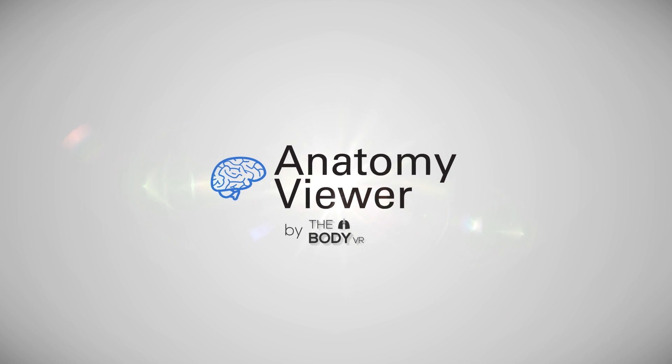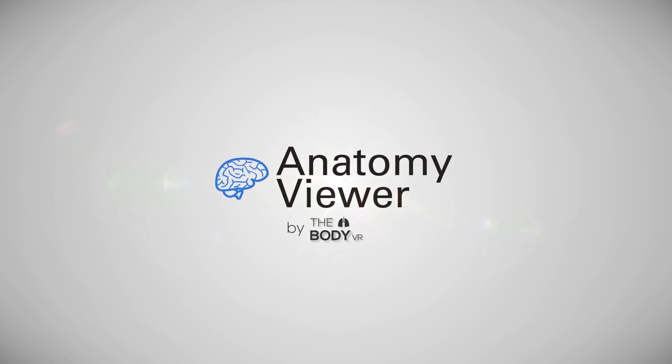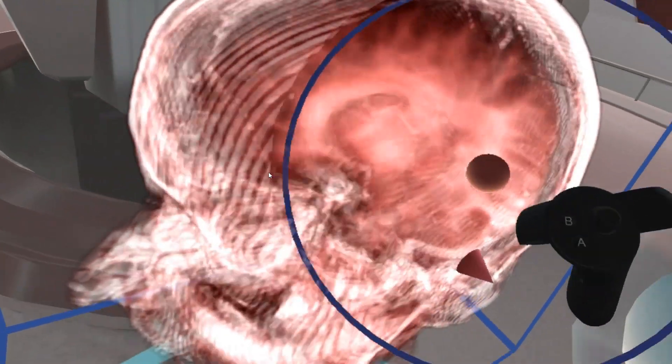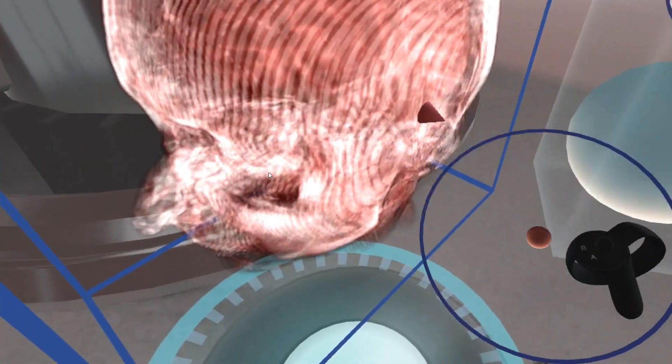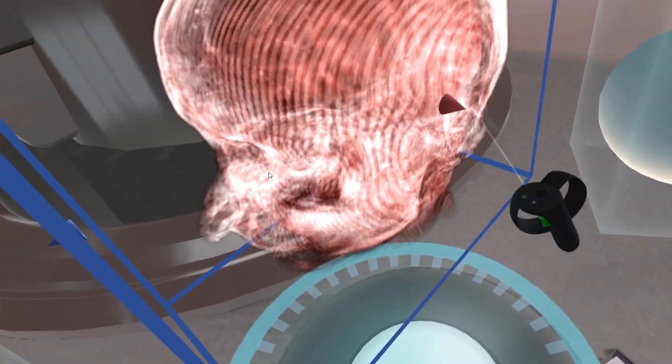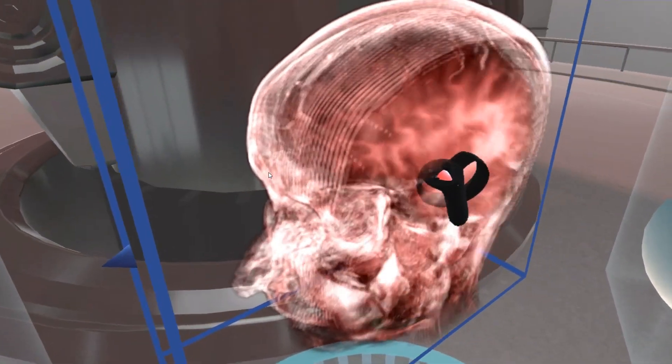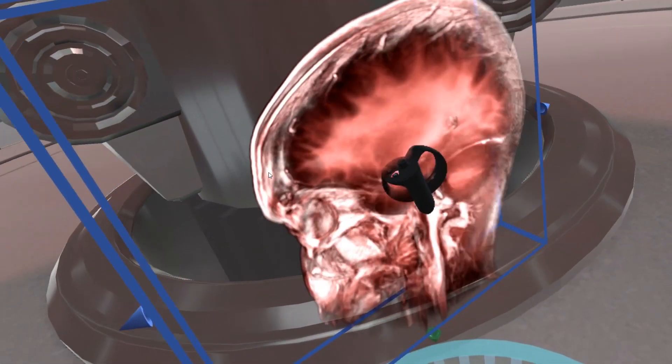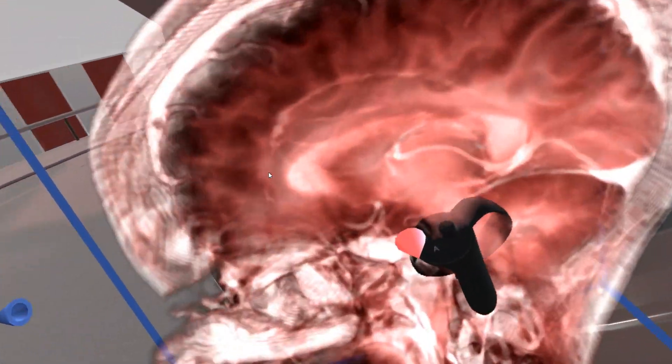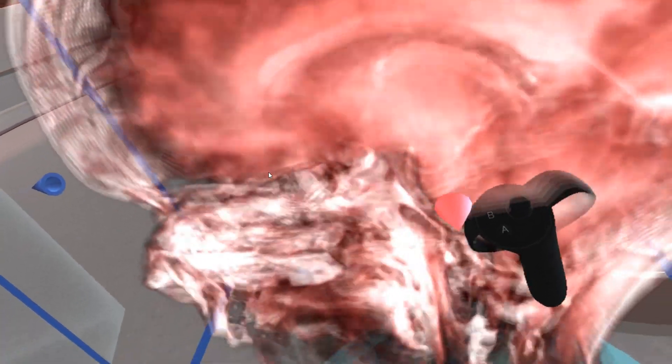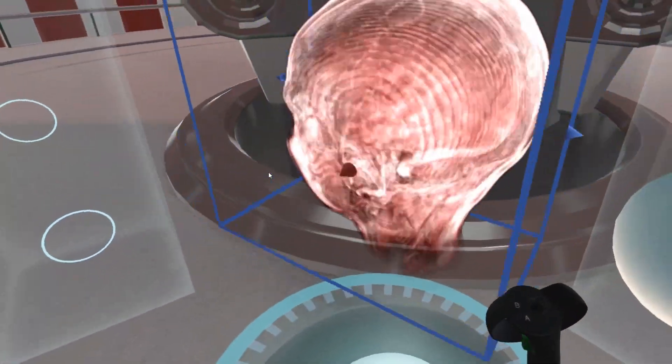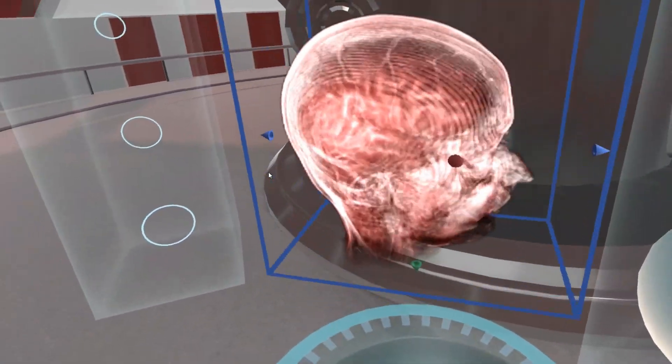Introducing Anatomy Viewer by the Body VR. Anatomy Viewer allows anyone with an HTC Vive or Oculus Rift to view CT and MRI scans as 3D volumes in virtual reality.